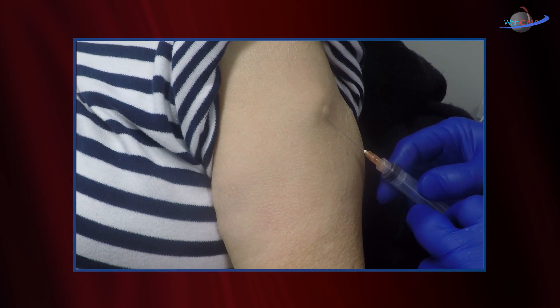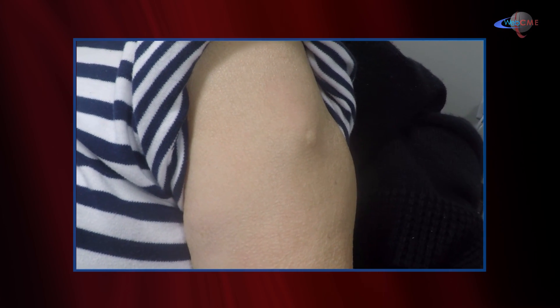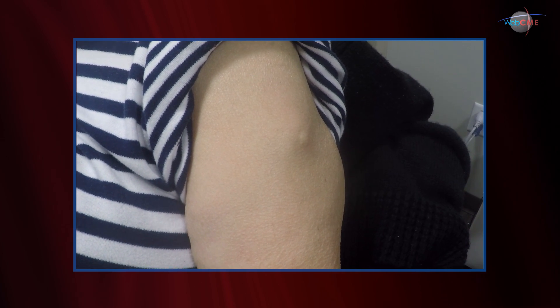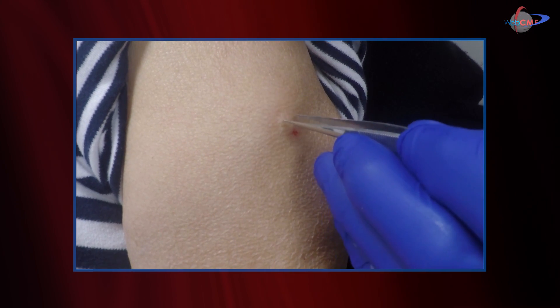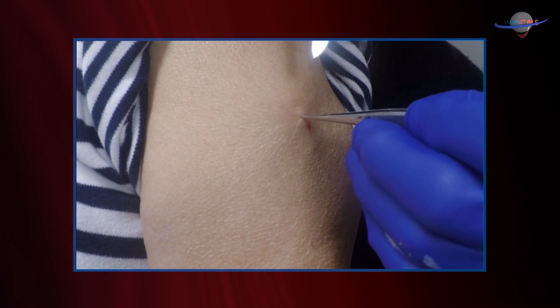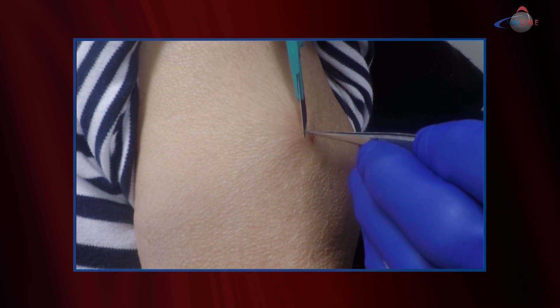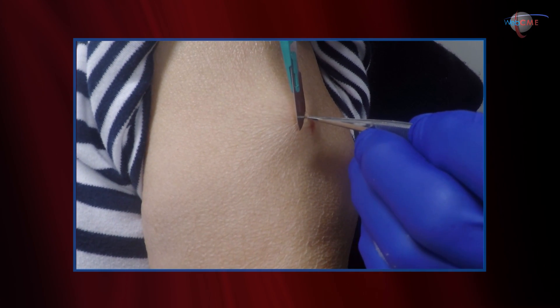This accomplishes two things. Not only is it going to give us some anesthetic, but it also raises that little epidermal blister that we can harvest a little easier. Essentially what we're going to be doing in harvesting is just a little pinch graft — I'm going to take that little epidermal blister area, pick it up, and just take a little slice of that epidermis.